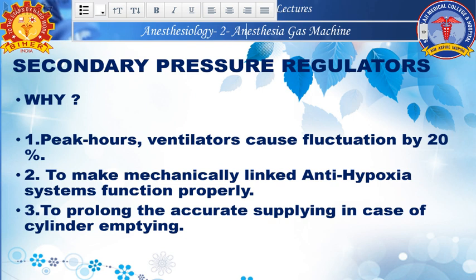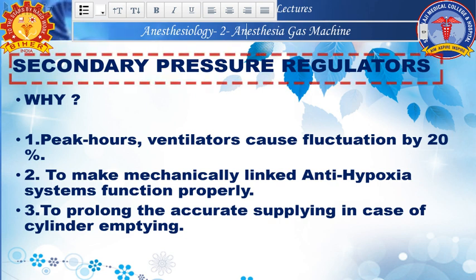Now we talked about primary pressure regulators. Coming to the secondary pressure regulators, why should we have another regulator? Already we have regulated the pressure. Why should we have the secondary pressure regulator?